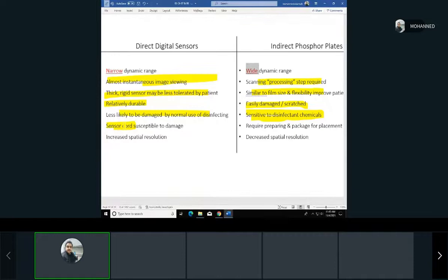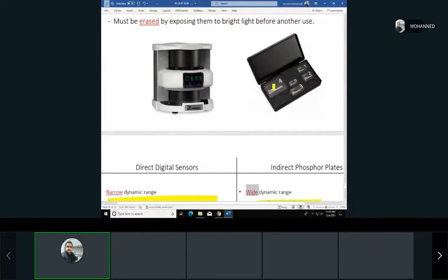These would have a container, an envelope that we put them in, so we don't use them directly. We put them in an envelope, close it, and then use it, and then we break the envelope and take the X-ray out. So it will be covered with a plastic envelope, and you'll see that again when you use these. That will protect them a little bit as well.